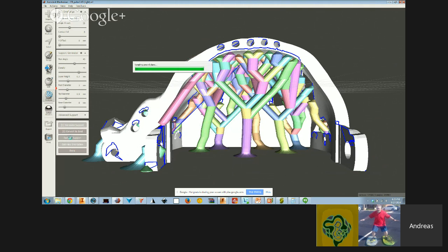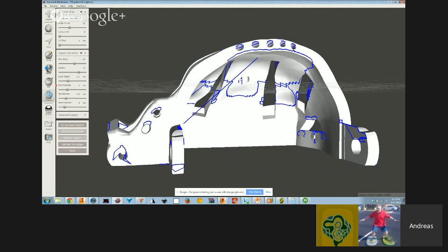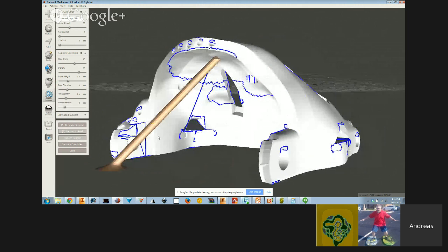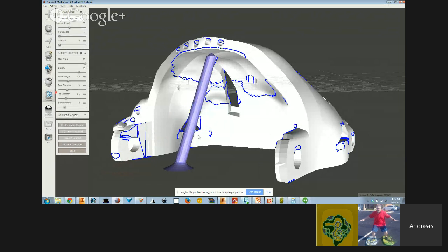So I can remove support here, which gets rid of the support that it proposed. And I can use the overhang reference to go in and put my own struts, my own basically supports. So let's just focus on this area up here in the upper dome. If I just left-click anywhere there, it adds a strut there. Okay, and you can see it's kind of angling out. If I don't want that to happen, this max angle setting will adjust that. So let's say, just for seeing it, bump it up to 70, and I'll Control-click on this one because I don't like it. And then I'll click there again, and now it's at much less of an angle.